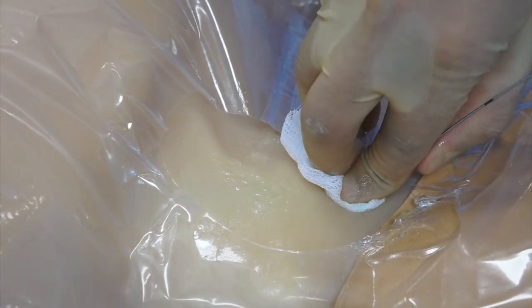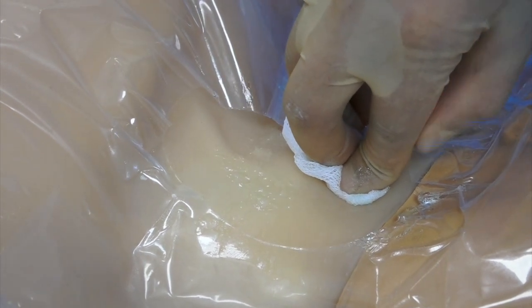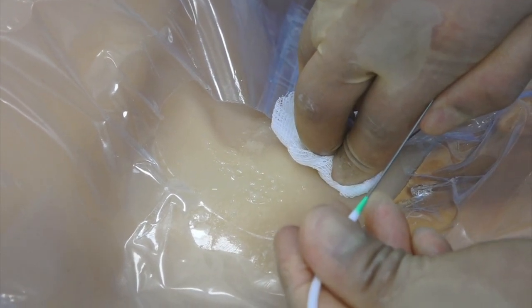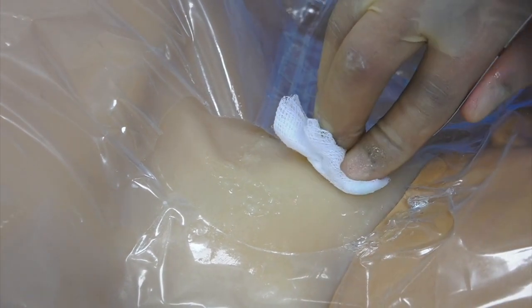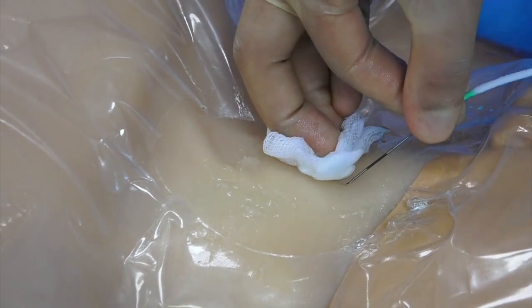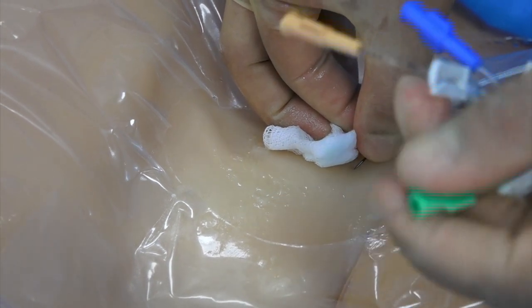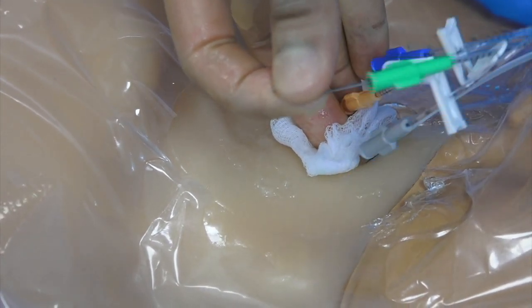Apply pressure with gauze to reduce bleeding and advance the dilator using a twisting motion. Be careful not to kink the wire with the dilator. If significant resistance is felt, it is likely that the skin incision needs to be enlarged. Thread the central venous catheter over the guide wire, being careful not to advance the guide wire too deep. Hold the tip of the guide wire to prevent it being lost into the patient's thorax.